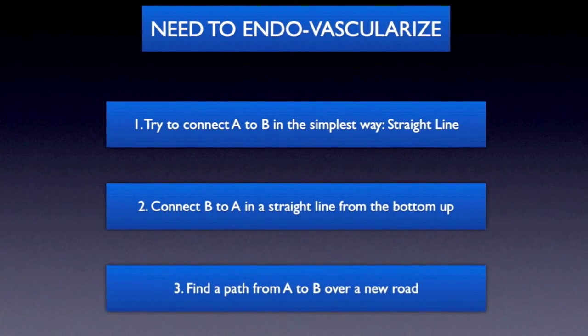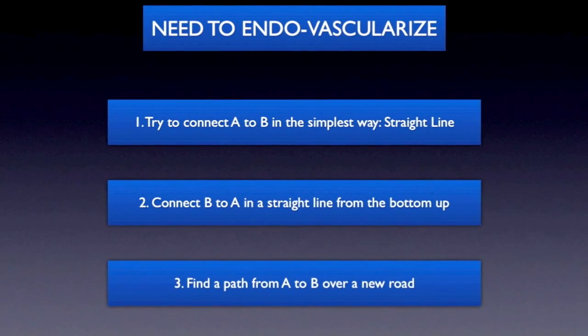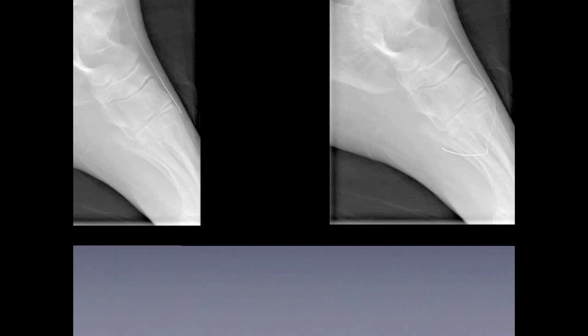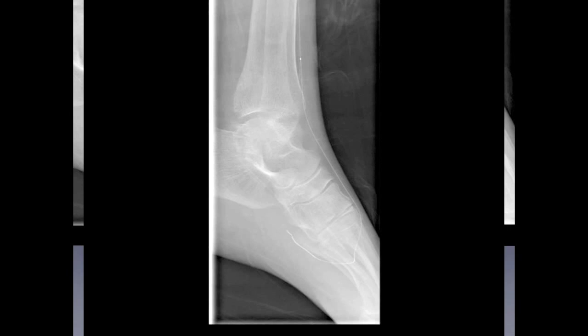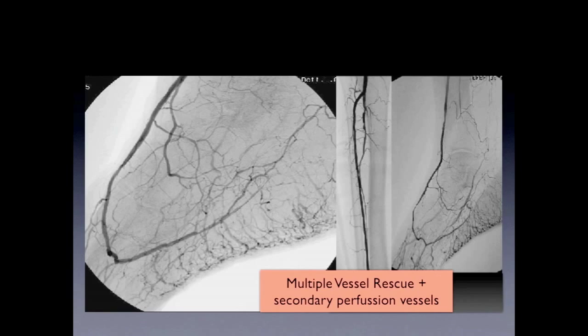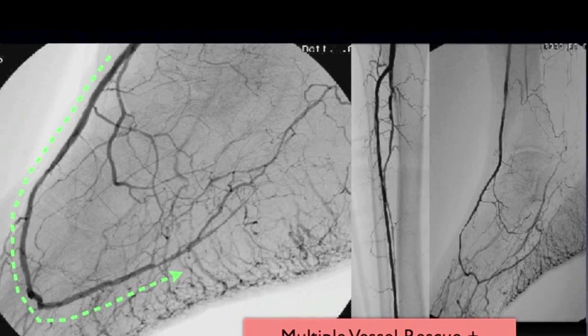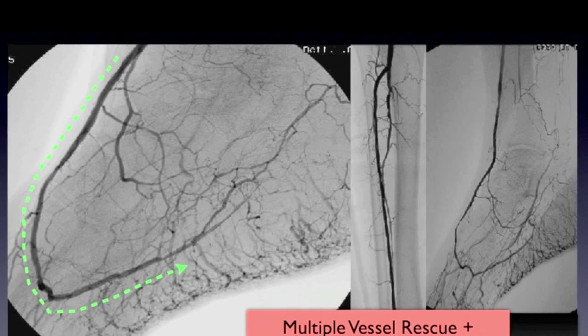Remember, if you can't connect A to B or B to A, then find another path to get from A to B. In this last case, there's no way to acquire a posterior tibial, either retrograde or antegrade. So what you could do is start going through the connections between the anterior perfusion and the posterior perfusion. You could actually find some of the transmetatarsal bridges that would allow you, with patience and the adequate hydrophilic wire, to maneuver yourself from the dorsalis pedis circulation into the plantar circulation. Once you do that, that allows you to engage into the artery in a retrograde fashion, do an angioplasty, and actually retroperfuse an angiosome that's hypoperfused, which is great in cases of orphan heel syndrome.